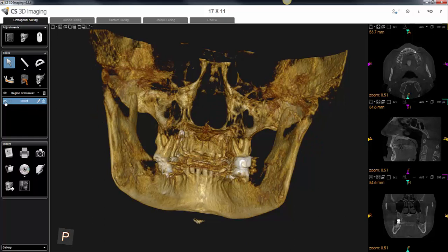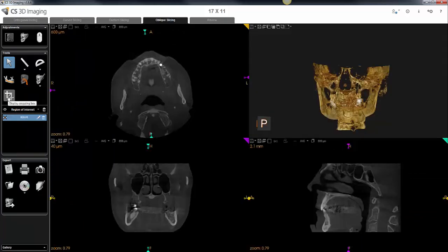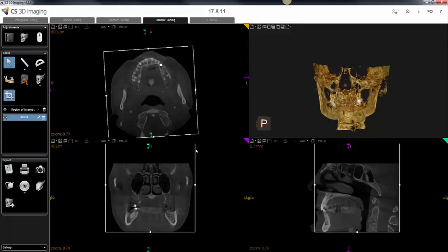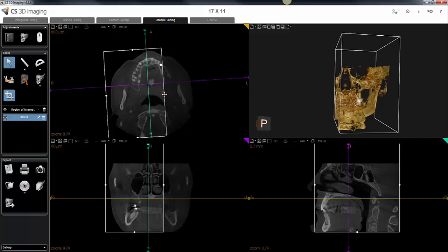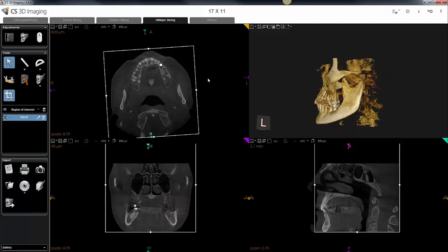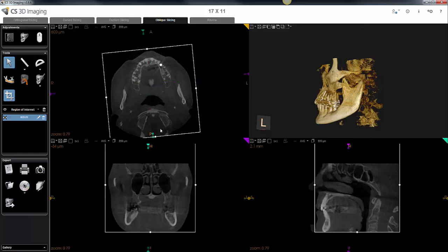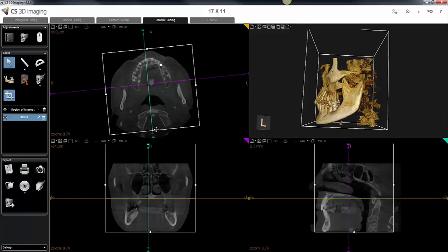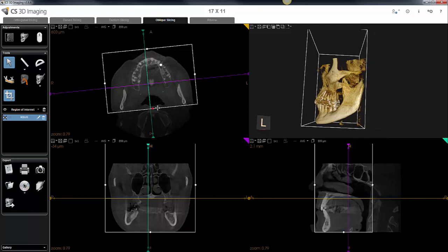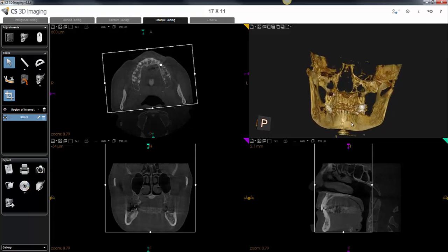So that's one way. The second way is with a tool in the oblique slicing tab — a cropping tool. When we click on this tool you'll see a box appear. Each side of the box has a landmark or icon that you can grab to bring that side of the box in and crop out anything outside the box. In this case I'll change the angulation so that the back edge of the box is perpendicular to the spine, then grab that marker on the back of the box and slowly slide it in until what I'd like to remove is removed. That might be a quicker way to do what we're trying to do here.